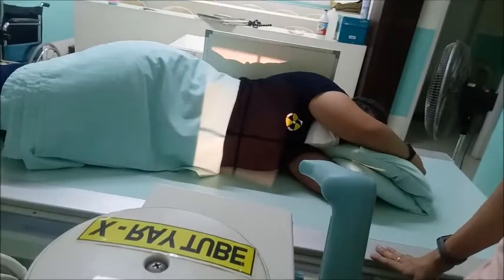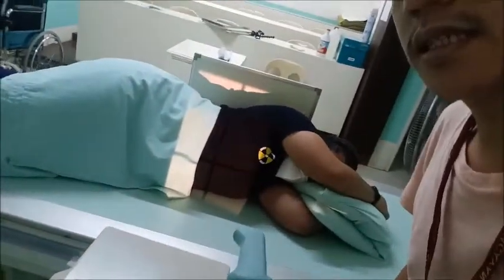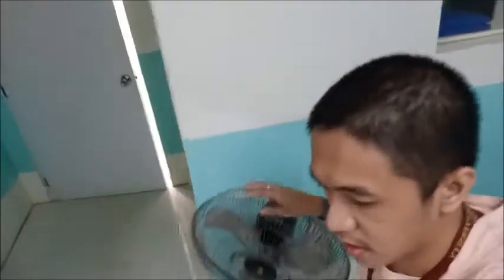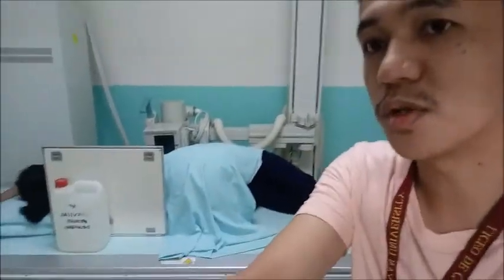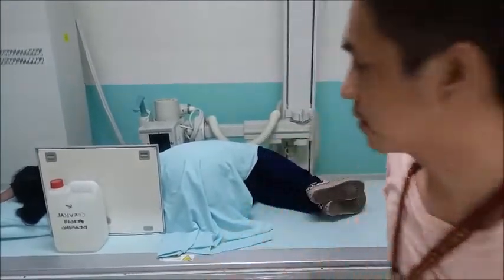Okay, so we'll move the table. Again, the affected side is the side that will be placed closest towards the table. The purpose of the decubitus, and also the upright, especially for pleural effusion, is to demonstrate the air fluid level.